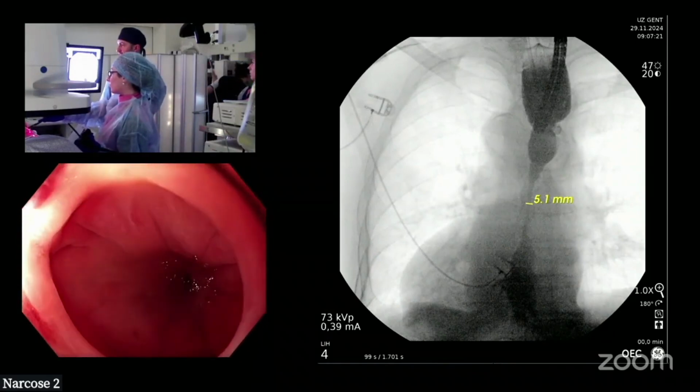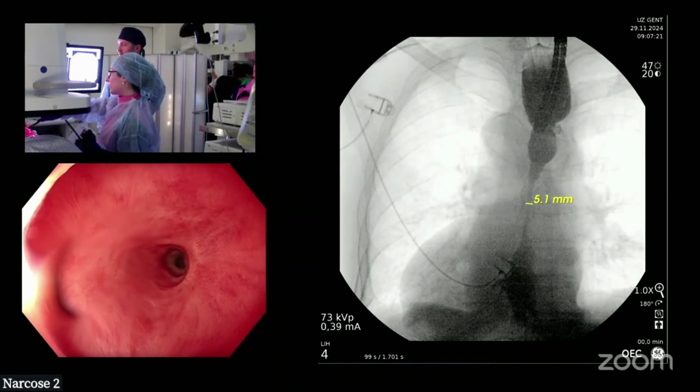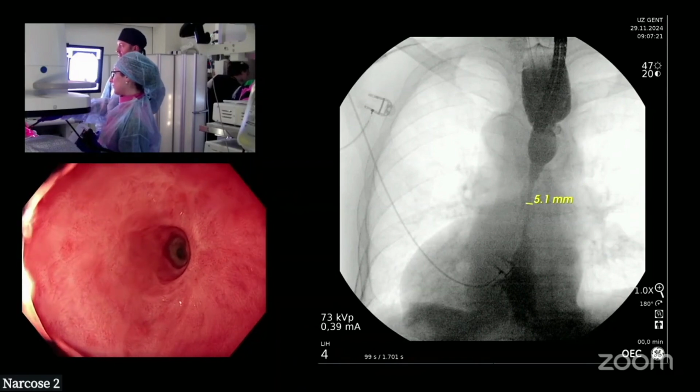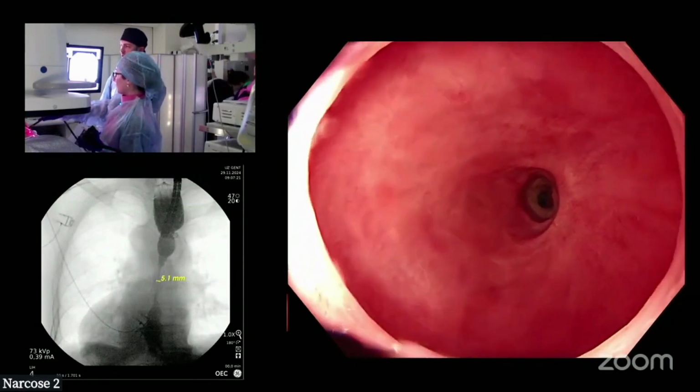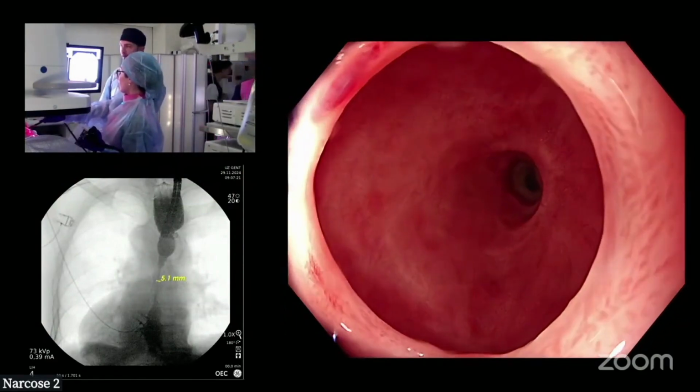You now inflate maximally and look in the distance. So, yeah, maybe it's right. Seems small. It seems very small, and it tapers down, as you can see on the X-ray image. Okay, so I would suggest, based upon this, that we now choose the dilator size before we do the incisional therapy. What would you choose?